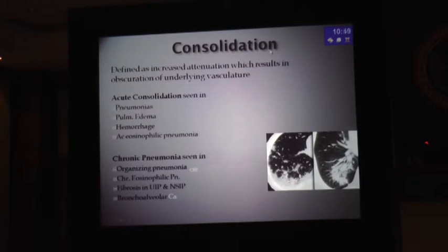So the last of these categories of lung airspace opacification is consolidation, and consolidations can be central, peripheral, multiple, lobar, and their distribution also gives us a clue to diagnosis. So this is a predominantly peripheral, multiple small consolidations of organizing pneumonia, or we can give a differential of eosinophilic pneumonia if the patient has peripheral eosinophilia.